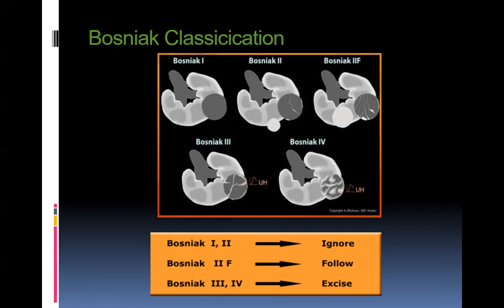When you measure this septal enhancement, by enhancement I mean you do a plain study and a post-contrast study, and then you measure whether there is any difference between the pre-contrast and the post-contrast study. So if the septa shows an enhancement of above 15 Hounsfield units, you consider it as something positive. Now, these cysts again should not have any solid component inside, because if there is a solid component inside, then it places these cysts in category 4 like this. You see, if you have a solid enhancing component inside, then it becomes category 4, which is obviously a malignant cyst.